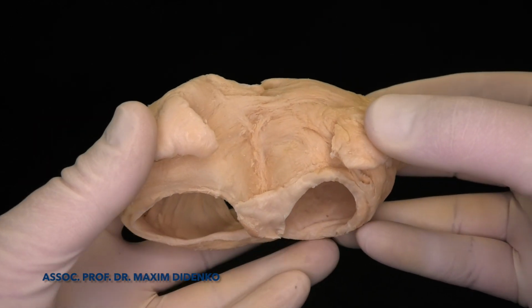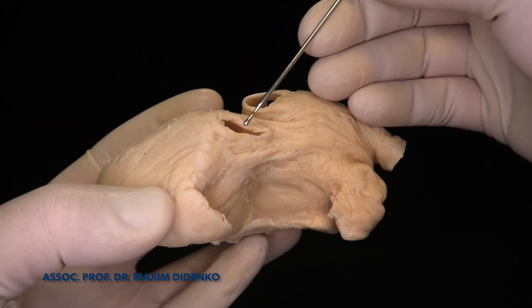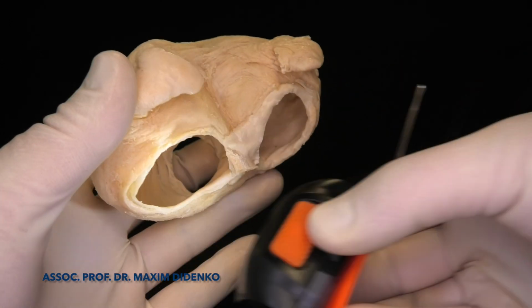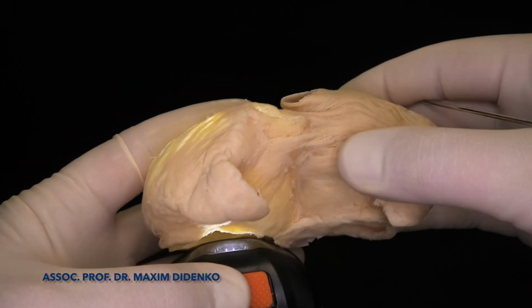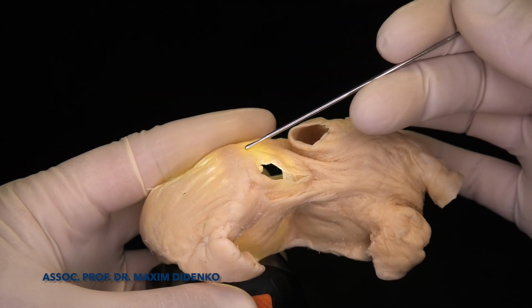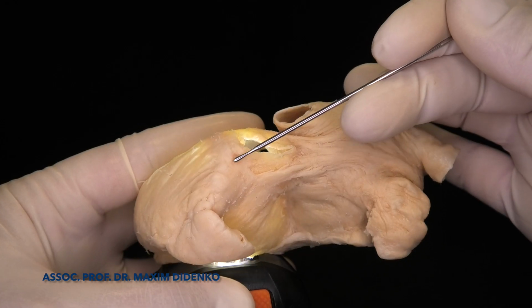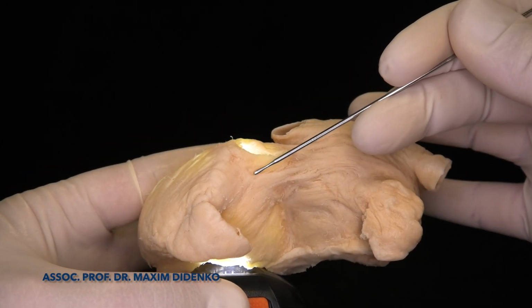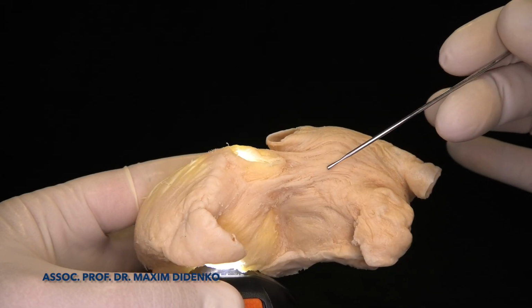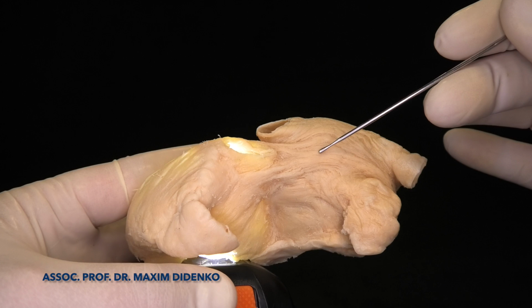And then the next, this is a so-called Bachmann's bundle. Again, you can see it's pretty fast from crista terminalis. I will make some trans-illumination to see it better, and we can see that from sinus node, which is located here, the fibers is going very fast towards to Bachmann's bundle, actually towards to the left atrium, anterior superior wall of the left atrium.